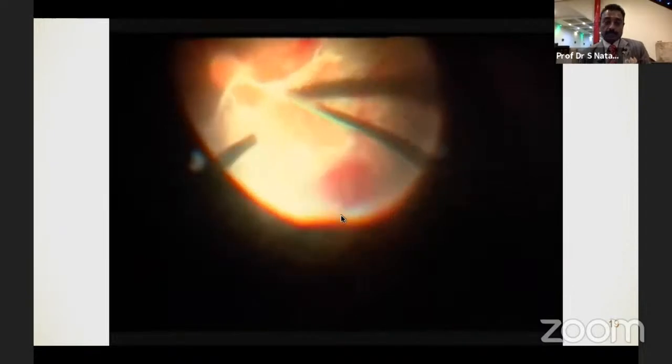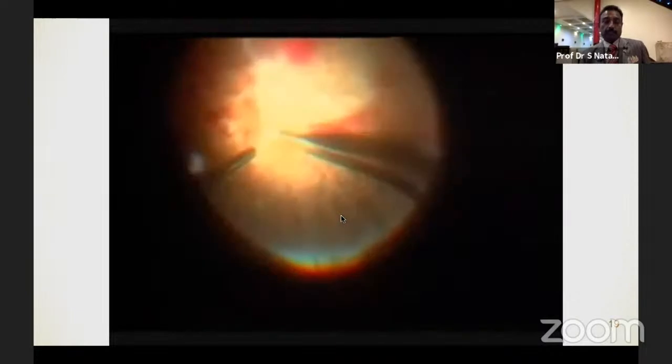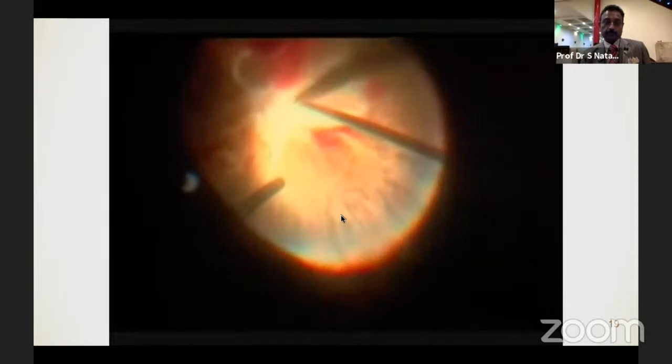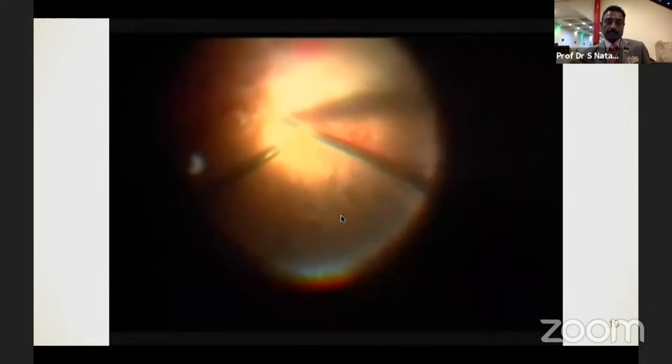Again, you have to assess the strength of the adhesion as well as the strength of the membrane and the weak retina beneath, because when you pull, there's a risk of traction when using the forceps. I think that's why Carl is introducing suction in membrane peeling. A similar thing is possible here. Use the proportional mode, separate the membrane, and then use the cutter and the suction so that you can trim from the convex side of the fibrovascular proliferation. You can see the blood is being pushed out. It is like they suck and spit.